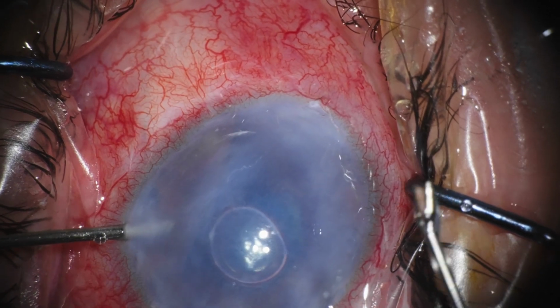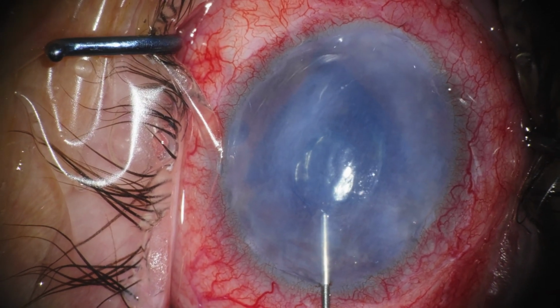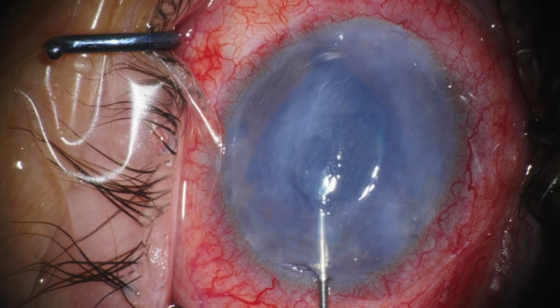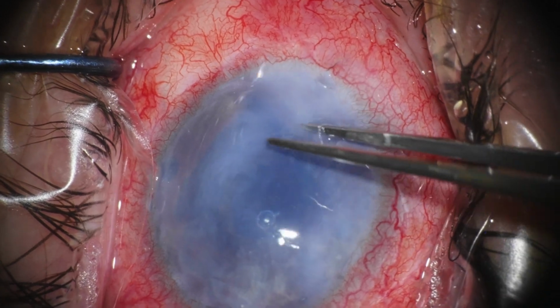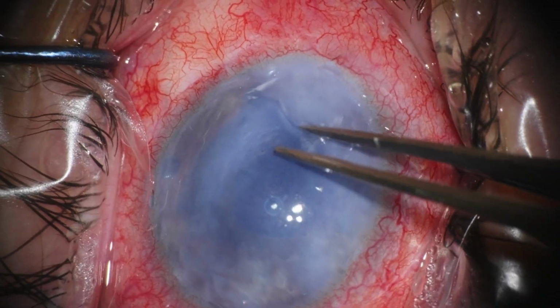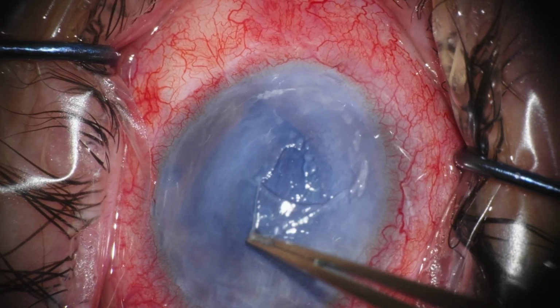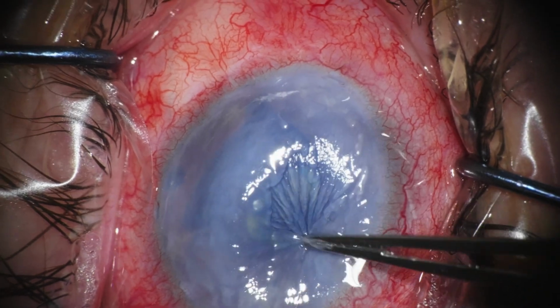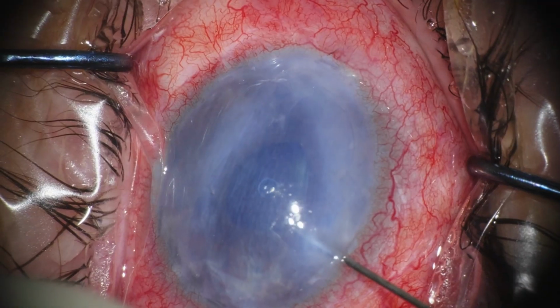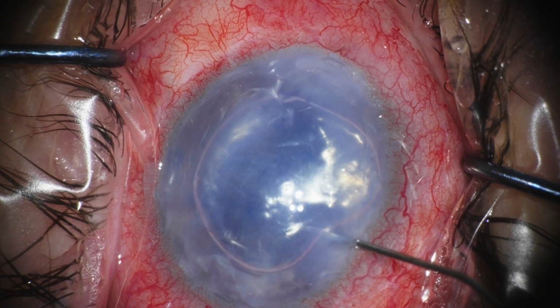So now we've used the irrigation cannula in the left hand and the direct manipulation forceps in the right, and we're not very happy with the way that the graft folded, and we're starting to lose graft orientation and even our perception of how the graft is positioned. So we want to do something to improve our view, and that is de-epithelializing part of the cornea.